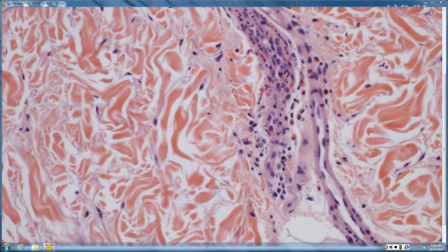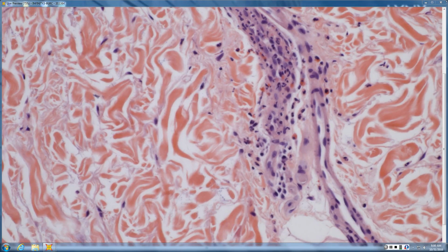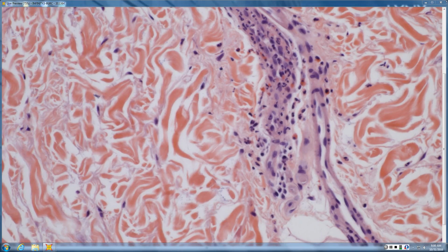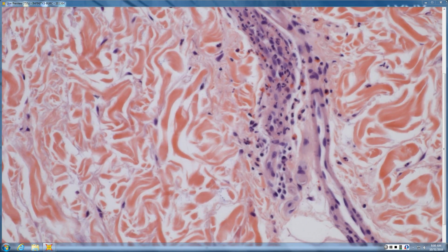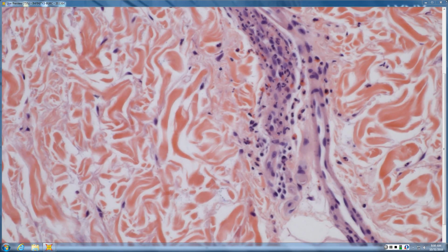So Brian, jump in. How would Still's look different from urticaria? I feel like you might have more of a karyorrhectic look. No. Still's doesn't get karyorrhexis either, but it also doesn't get the EOs. So Still's looks just like urticaria, except it stays neutrophilic. The EOs don't show up. In Still's, the EOs weren't invited to the party. It's really sad. They never got an invitation. They feel left out. But Still's disease looks just like urticaria, except that the EOs never join in.